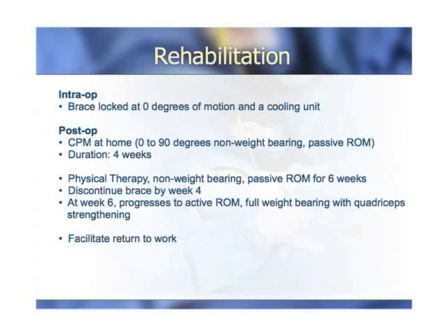I'm going to briefly go over the rehab, and skip over the techniques, because that's going to be addressed in the lab. But one of the things that I do right away is I get them going with range of motion, but I do not weight bear them. The rationale for not weight bearing them is that these are plasma sprayed posteriorly on the implant, and the whole idea here is to get a biologic fixation. Now, there's two types: ingrowth and on-growth. So this would be an on-growth because we're not dealing with pore sizes.